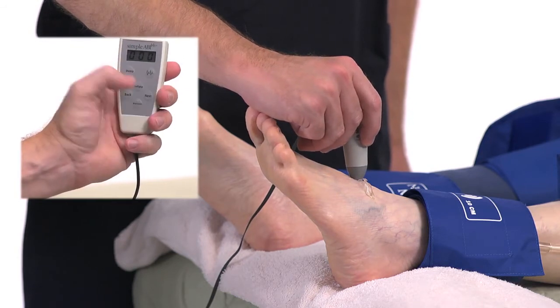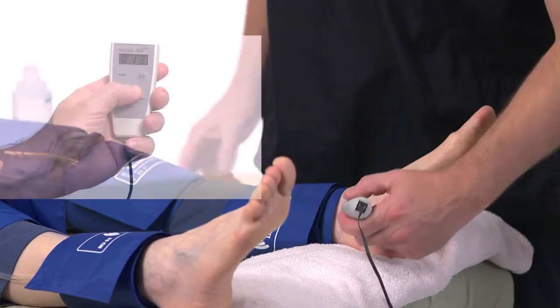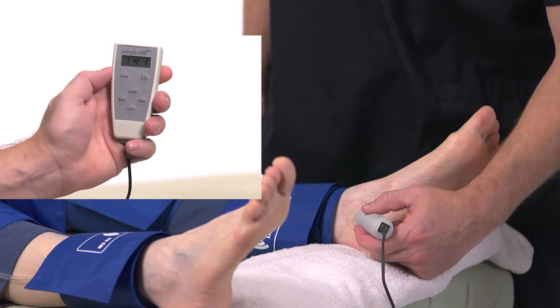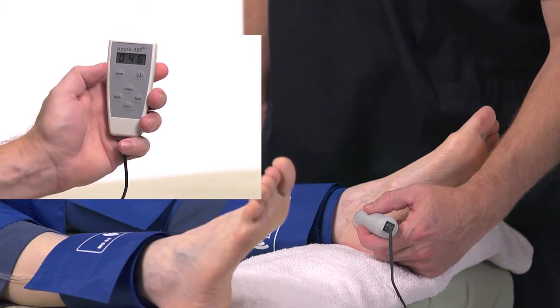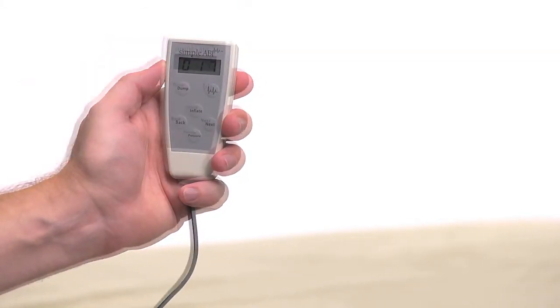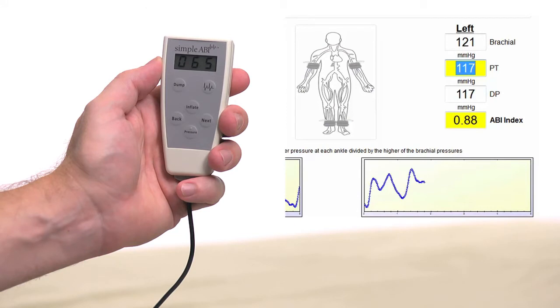Press Next to move to the left PT field. At the left PT, find a good Doppler signal. Press and hold Inflate until blood flow is occluded plus 20 millimeters. Release the Inflate button to begin deflation and press Pressure when blood flow returns. The left PT pressure will be entered in the left PT field. Press Dump to release the pressure in the cuff and prepare to take a PVR waveform. Obtain a PVR waveform at this ankle cuff by pressing the button with the waveform image on the remote. The cuff will inflate to the proper pressure and hold that while the waveform is obtained. Pressing Dump or Next will release the pressure in the cuff.